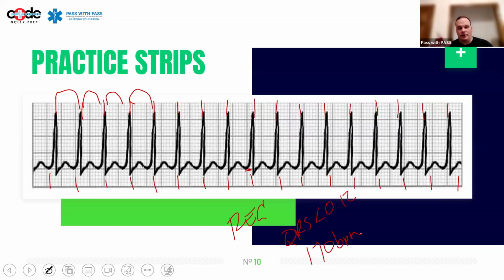So now, on the second slide of this, or third slide of this, when we talked about SVT, I talked about SVT being an umbrella rhythm. There is truly no such rhythm as SVT. SVT is a term to classify a group of supraventricular tachycardic rhythms. Tachycardic rhythms that are narrow complex, and because they're narrow complex, we call them supraventricular, meaning they're coming from above the ventricles. Okay, so this is a perfect example of why that term SVT exists.